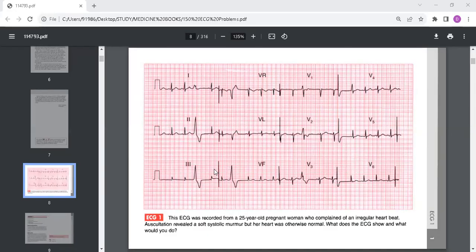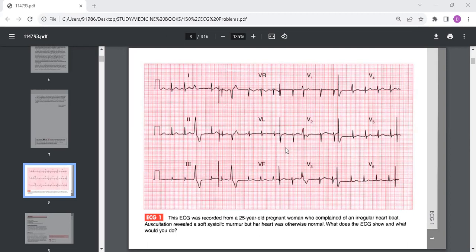We are going to start with the ECG series, revising around 150 ECG cases with a very famous classic book by John and Joanna Hampton and David Adler. We'll start with the first case. This is the old edition, the latest is the fifth one, this is the third edition.